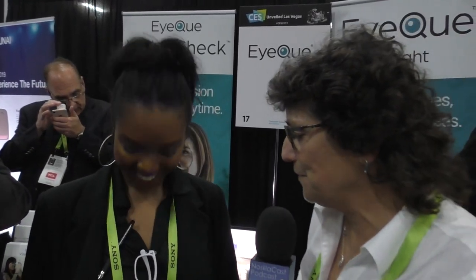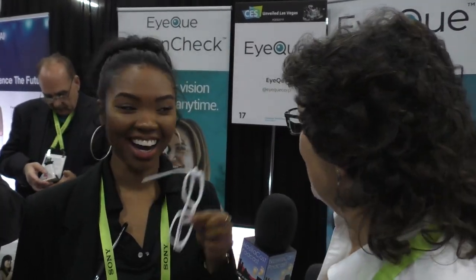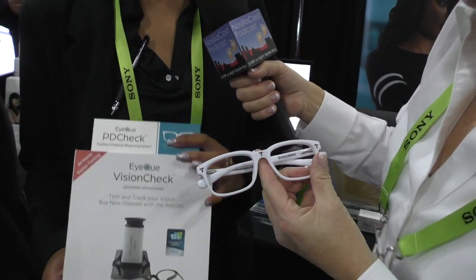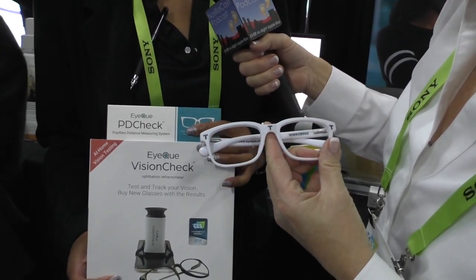I'm in the IQ booth with Jamie Neal and she's got these weird white glasses that have nothing in them on. I don't understand what's going on here — what on earth are you demoing? Absolutely, so we have a product called Vision Check, which just won an honoree award at CES this year, and it also comes with these crazy frames that you see here.